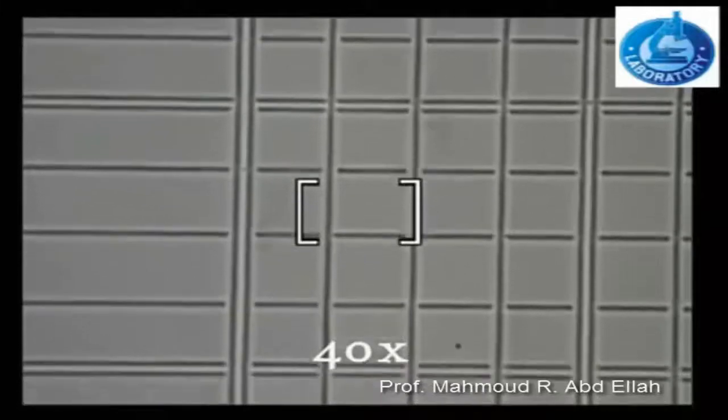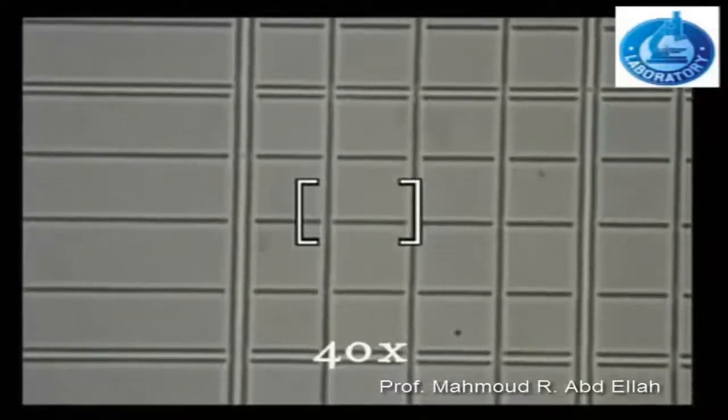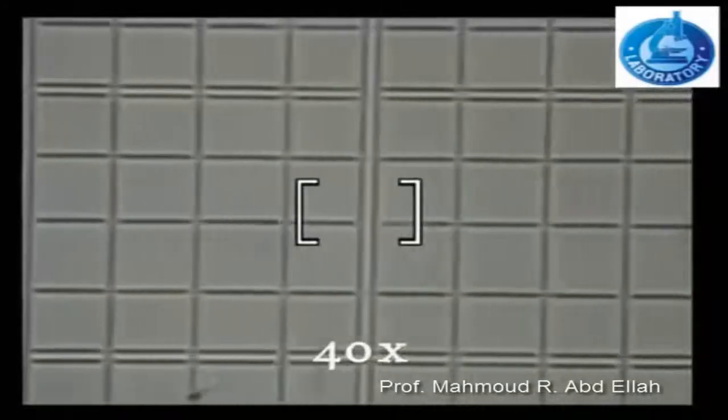As mentioned before, each one of the 25 squares present at the central area is divided into 16 squares. The central area is used for counting the red blood cells, and because the squares are small, the counting is done under high power magnification.